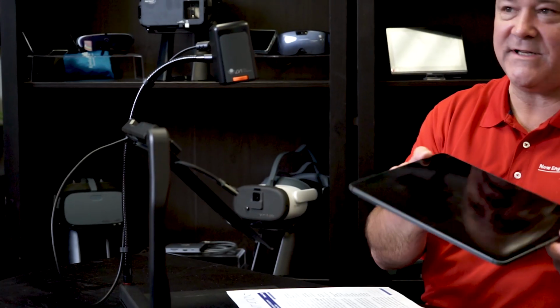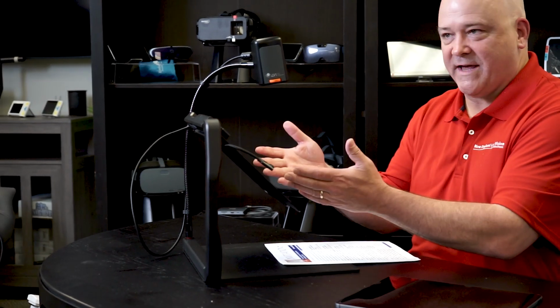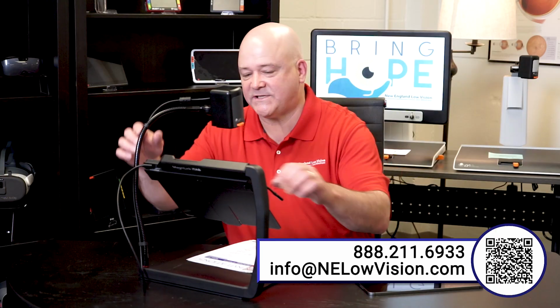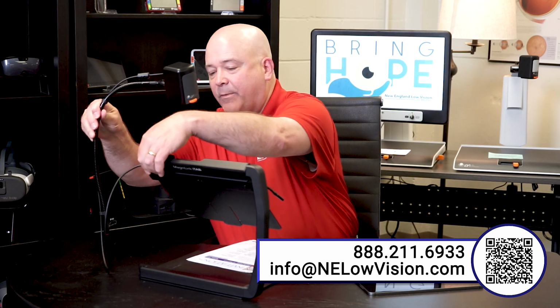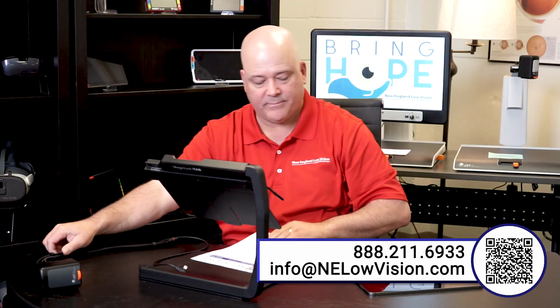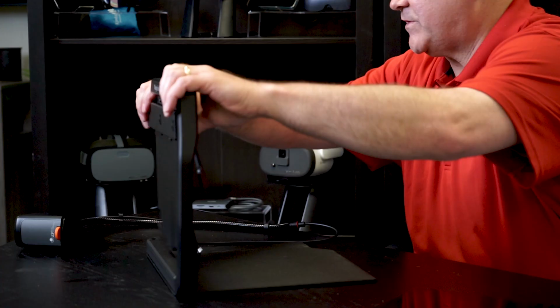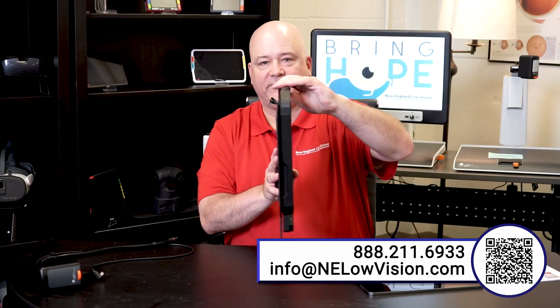All right, so you can use this as you would use your iPad normally, and then when you want to put it in the stand, you can put it in the stand. So the stand collapses pretty easy. So we're going to pop out the camera from the back, unhook the USB-C cord, and then this stand just folds down flat like this, and then you're off, and then you're on the go.